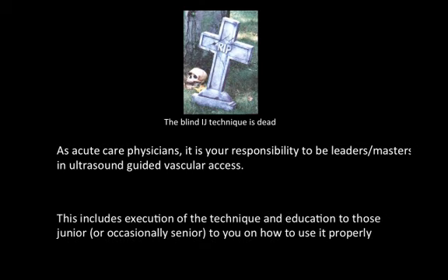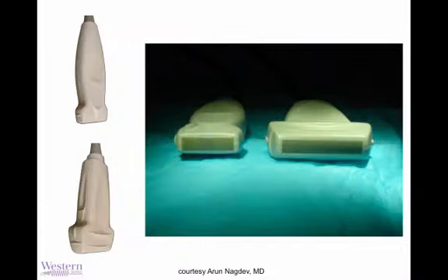And if you're a junior or even a senior resident watching this, I think this will inform you how to do this technique properly. Now, the equipment you'll need for this procedure, of course, is the machine, but the transducer of choice will be a linear array transducer, or the vascular transducer, as it's commonly called, used for its very, very high frequency and corresponding ability to really depict the needle and the vessel very vividly.